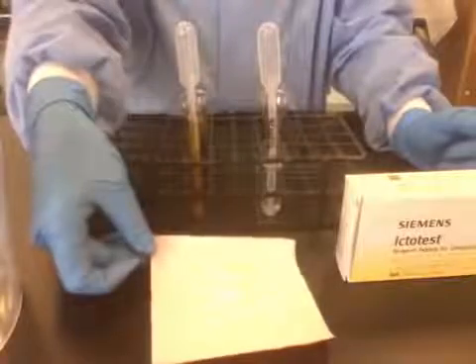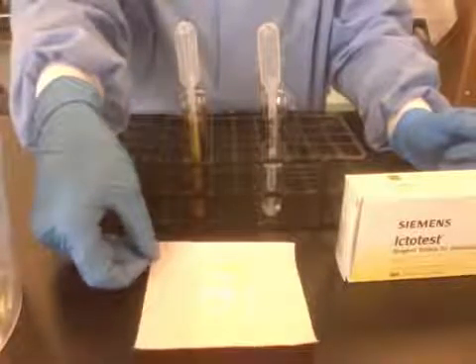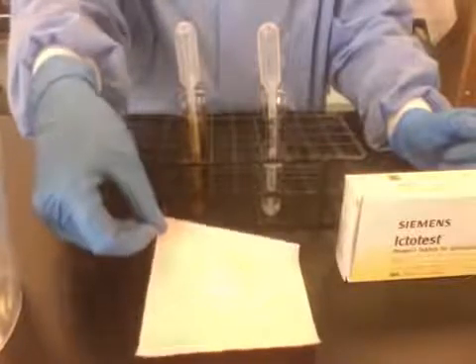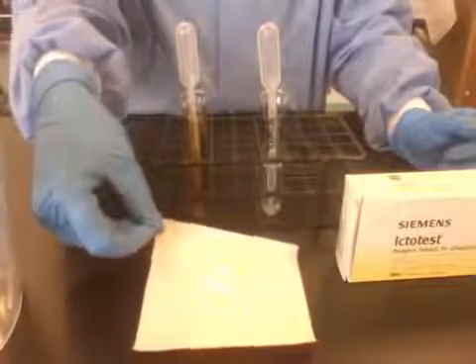A positive reaction is going to be dark purple, indigo color, whereas a negative reaction is either going to just stay yellow or be a sort of pink-red color.